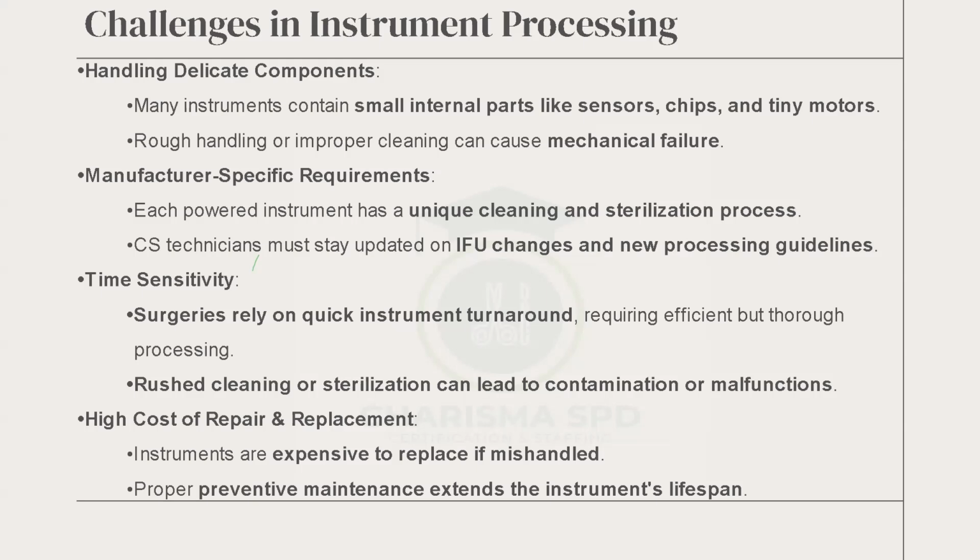So you have to handle it with care. Again, don't guess. Ask questions. Ask for help if you need to, so that they will help you to do the right thing. Manufacturer-specific requirement. Each powered instrument has a unique cleaning and sterilization process. We mentioned that already. You can get that by following the IFU. Technicians must stay updated on IFU changes and new processing guidelines.